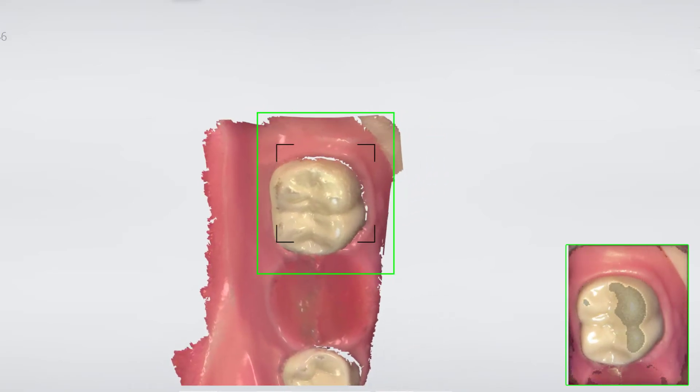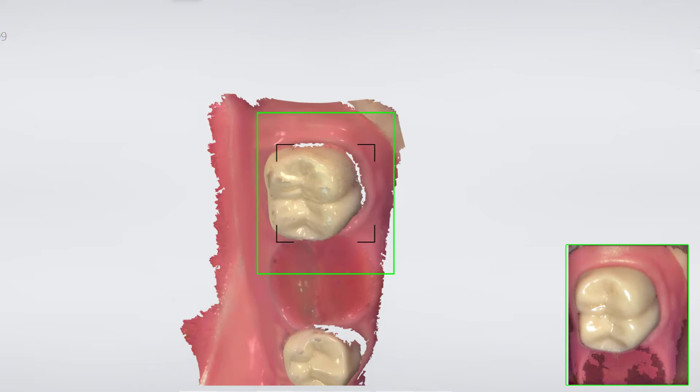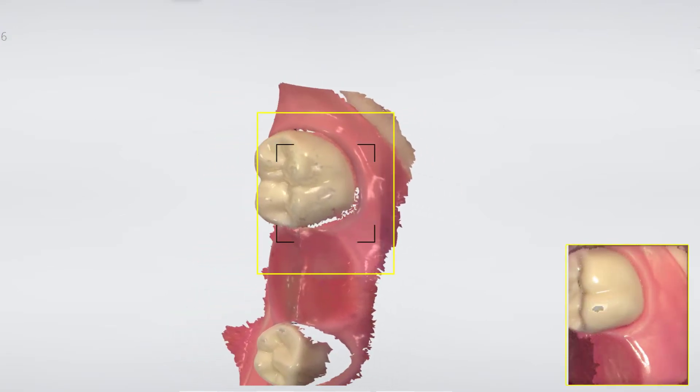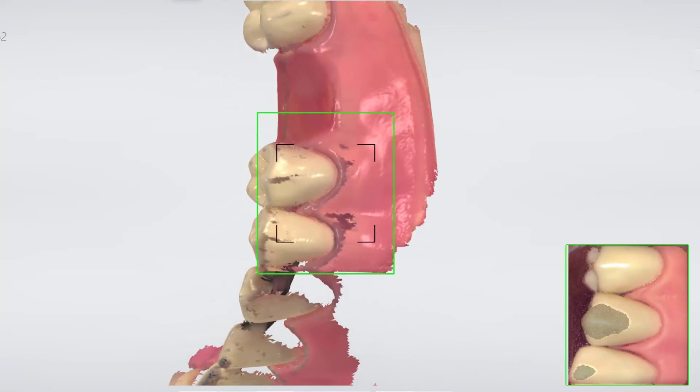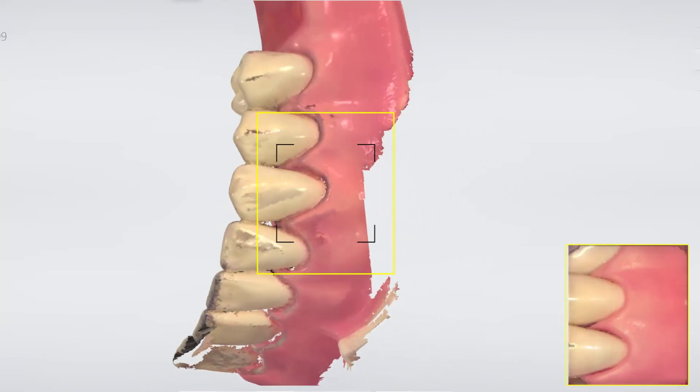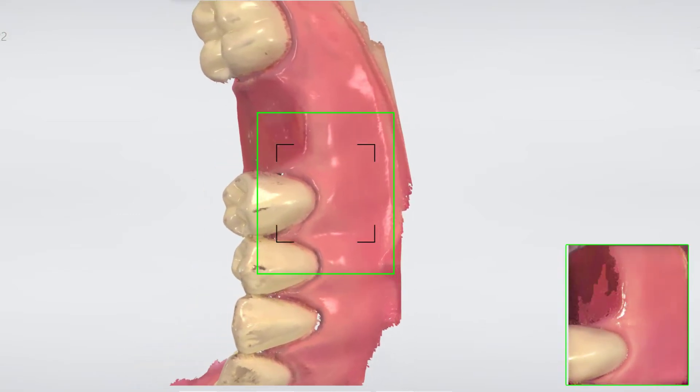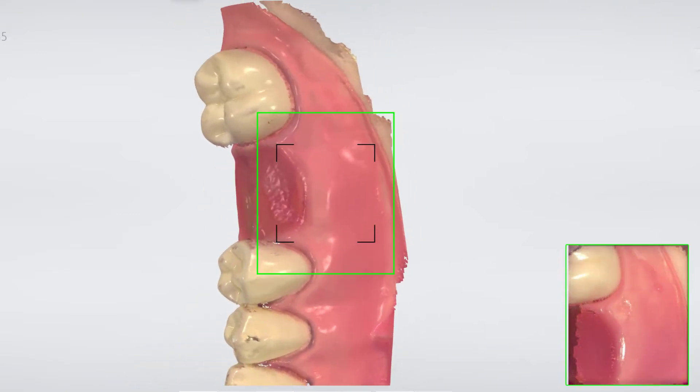Turn to the buccal side covering the area behind the molar — the retromolar area — in case we need the support for the guide. Go buccal again as deep as possible with a 70 to 80 degree angle to also cover the soft tissue.